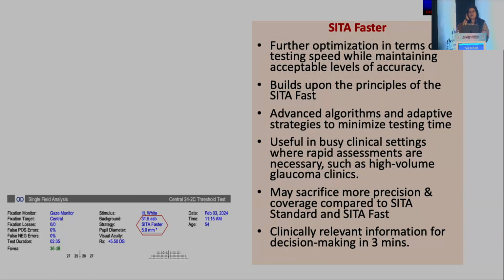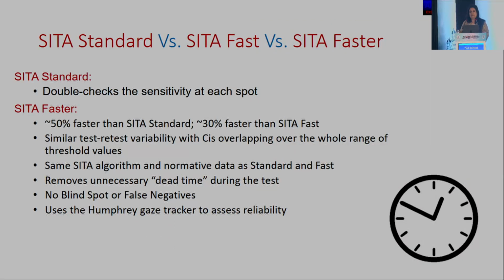but there is still a major group of glaucoma specialists who still don't really rely on SITA Faster, because it does tend to lose accuracy when we are talking about patients where critical decision making is to be made, especially when we are focusing at the central spots.